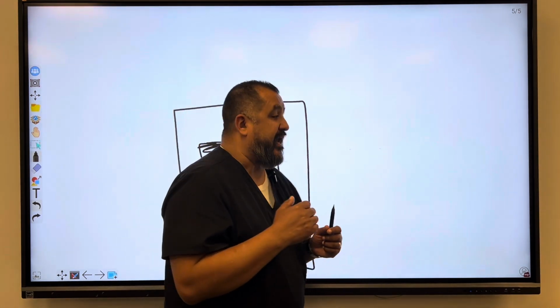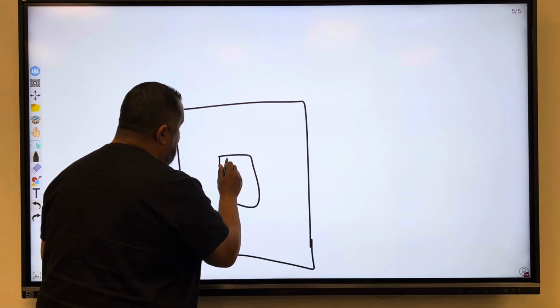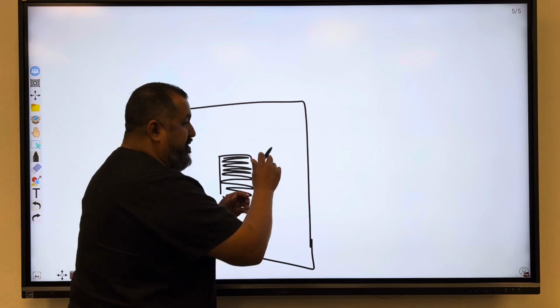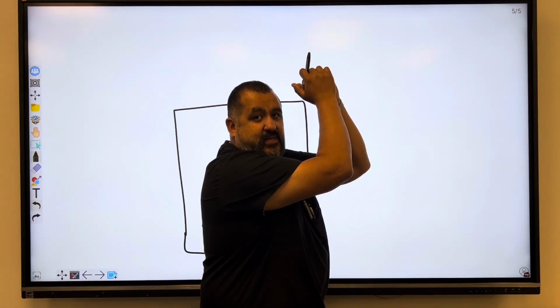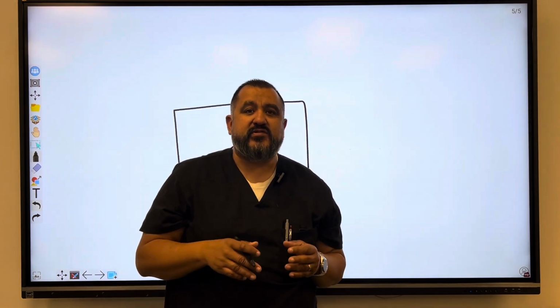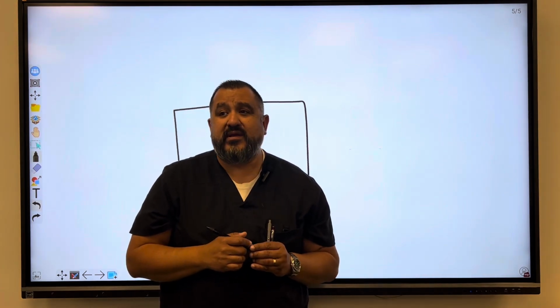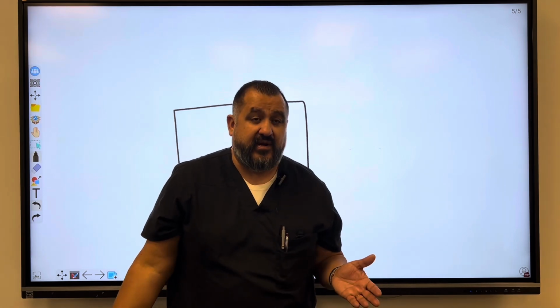So now if I do a lateral chest, well then we're only going to use the center chamber, just like this here, okay? So it's very important to place the area of interest over that chamber, because if you're off alignment a little bit, then it can really cause the image to be overexposed or underexposed, and that can have an impact on the patient as well, right?